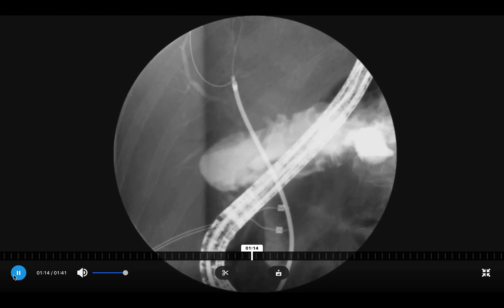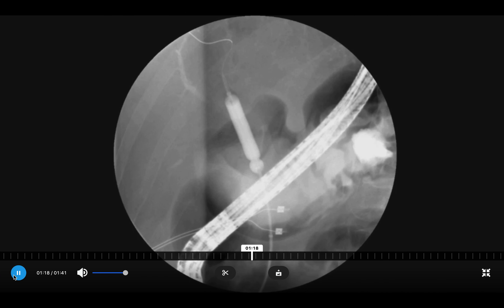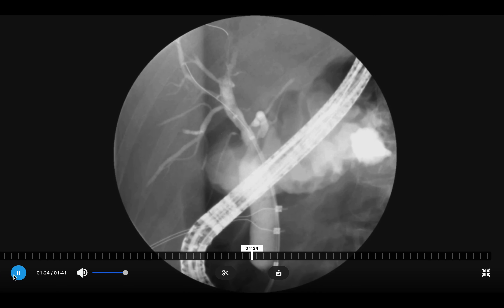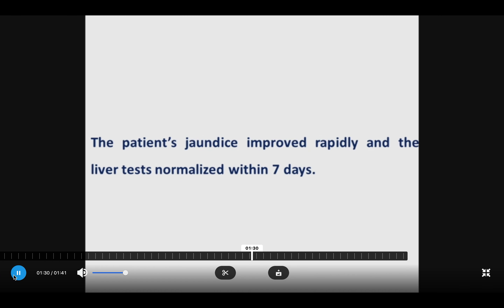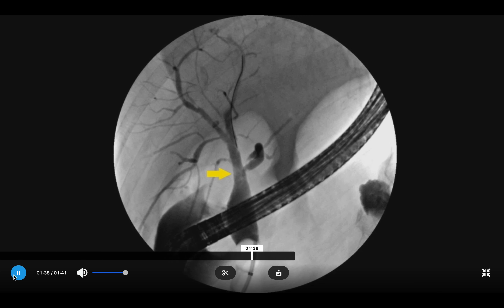After successfully traversing the stricture, it was dilated and then two plastic stents were inserted to improve remodeling of this complex bile duct stricture. On follow-up, the patient had quick return to normal liver tests, and three months later during ERCP the stenosis had resolved.